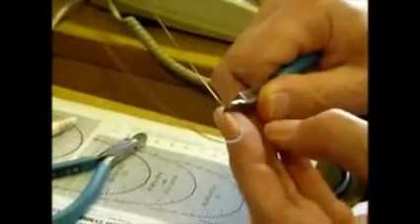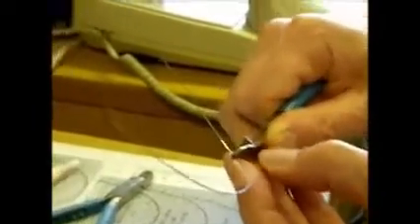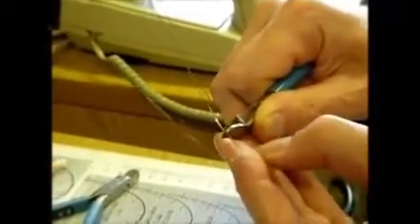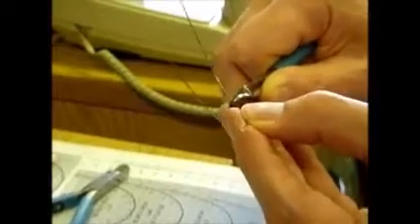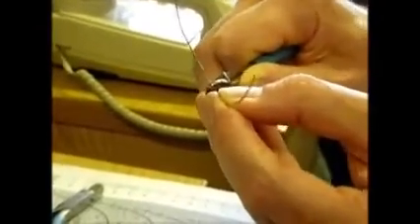Now once you've got the twist in, you then start to put the torque in. You've got at this stage a lot of negative torque in the buccal segment, but no positive torque. It just sort of flips up in the air, doesn't it? But if you start nibbling the torque in round the labial segment, and this is each little bit you push up from underneath, so you start to put the torque in round the wire, and you have to keep going around every millimetre or so. This is to get a gradual build up. Yeah, this is getting like the end of the velodrome, so the torque gradually builds up.